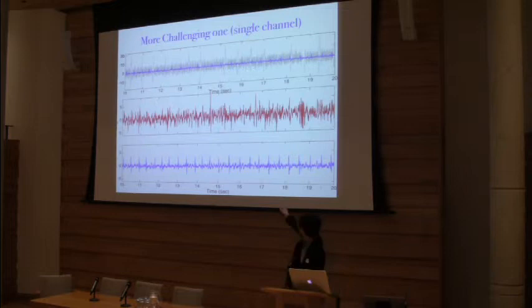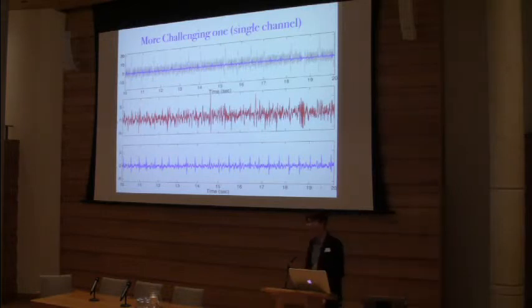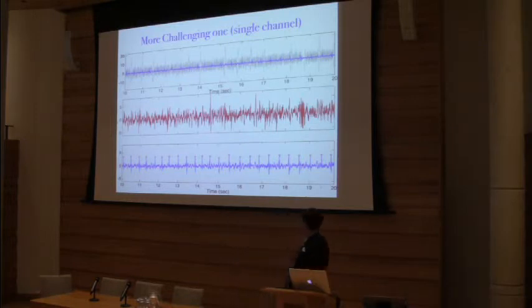And if you superimpose it, you see you can recover something which even cannot be seen by physicians' eyeballs. Then you will say, well, maybe this is artifact. How can you be so sure this is correct? Okay, we have some ground truth. Luckily, these are the R peaks detected from this final fetal ECG, and those circles are the R peaks recorded from direct contact fetal ECG.